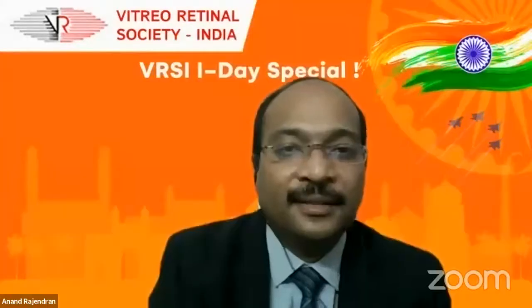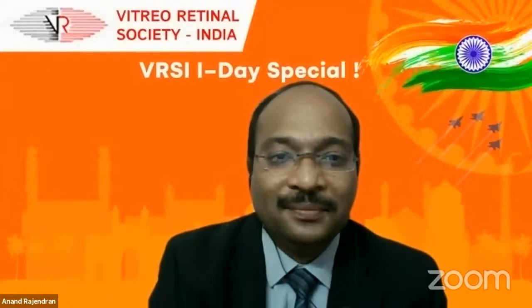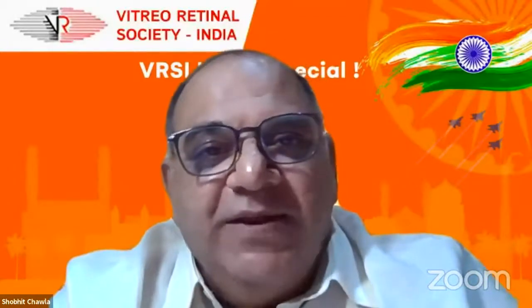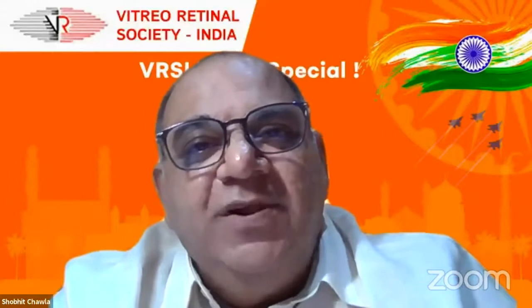Thank you, Sangeet. Terrific surgery. Dr. Shobit, your thoughts? Yeah, where you had the nasal break, Sangeet, very innovative technique, excellent videos also. But where you had the nasal break, could you have taken a nasal ILM flap and flapped it, a hinge flap?